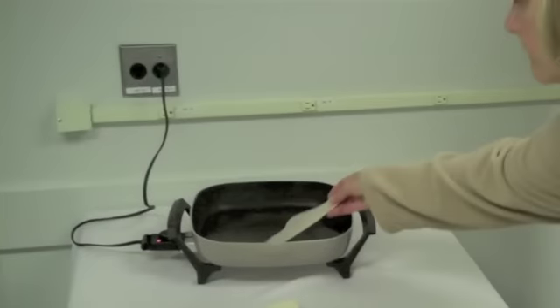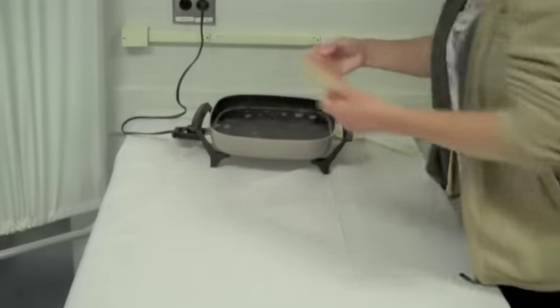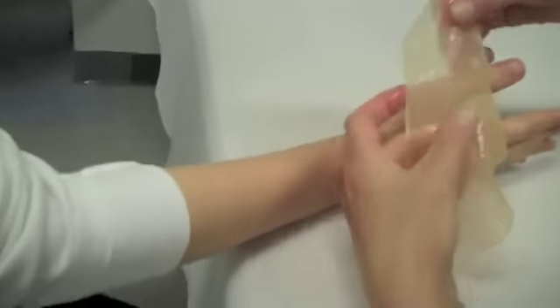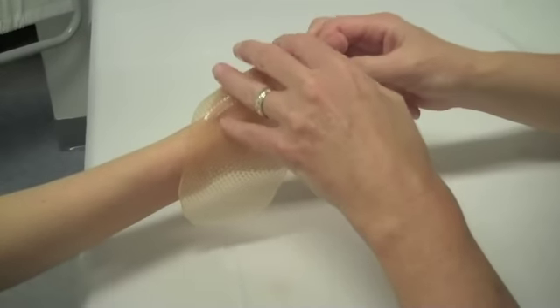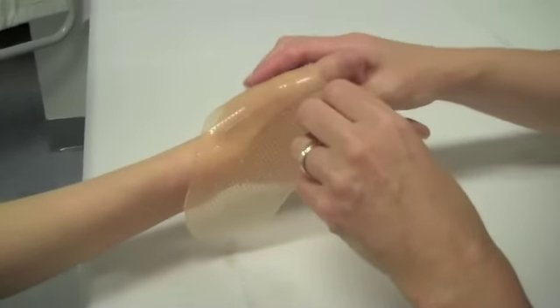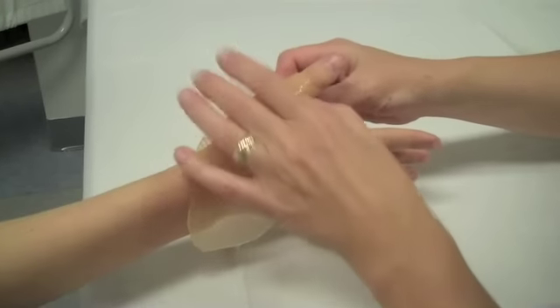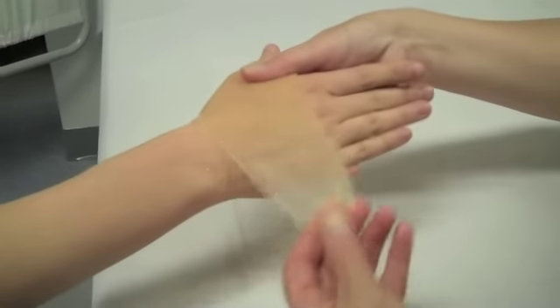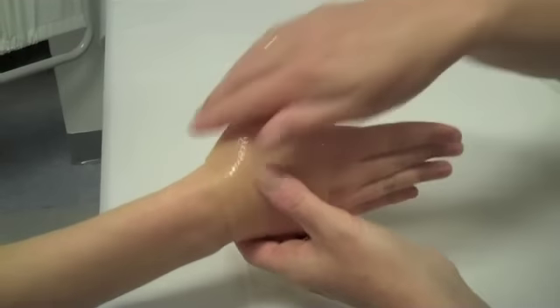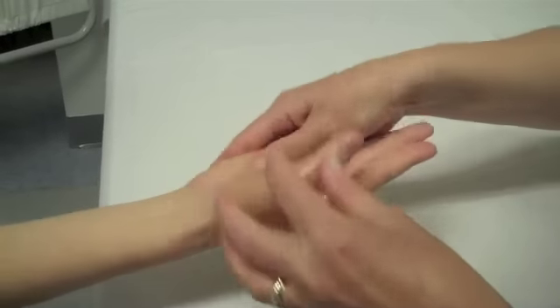Place the pattern into the deep electric water bath. Take out the heated material and place it around the patient's thumb and dorsal aspect of the hand. Make sure to pull the material up and over so that it covers the patient's first webspace. Pull the material ulnarly so that it wraps around the dorsal aspect of the patient's hand until it covers the patient's hypothenar eminence.